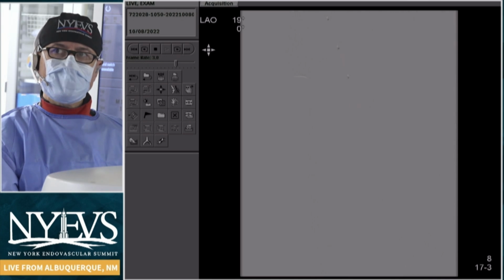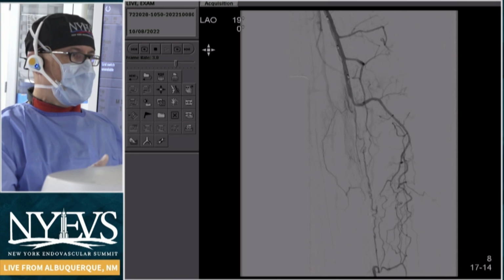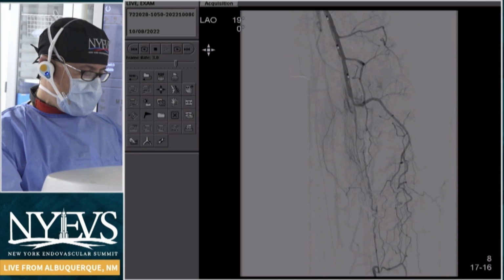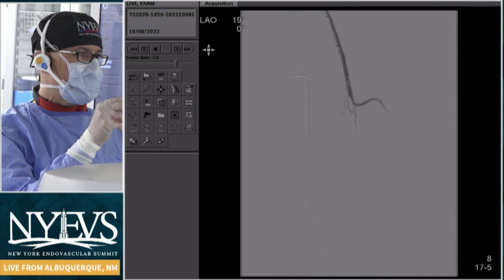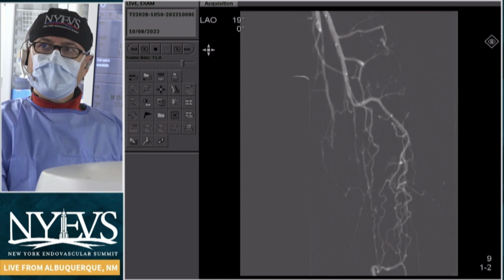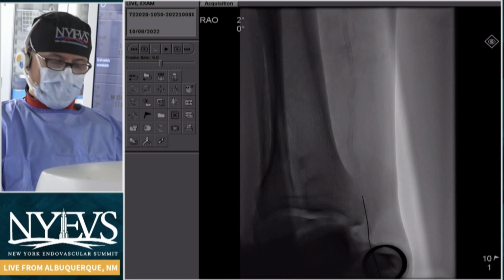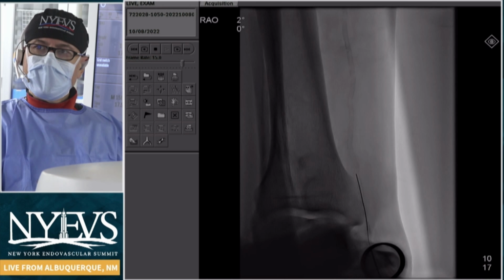In an attempt to steer back in from the top, I switched from my Mongo wire to a Halberd wire and shaped it in such a way that I would try to get back into the fibrous cap. Unfortunately, that simply was not going to behave very well for me. So I ended up coming in from the bottom.